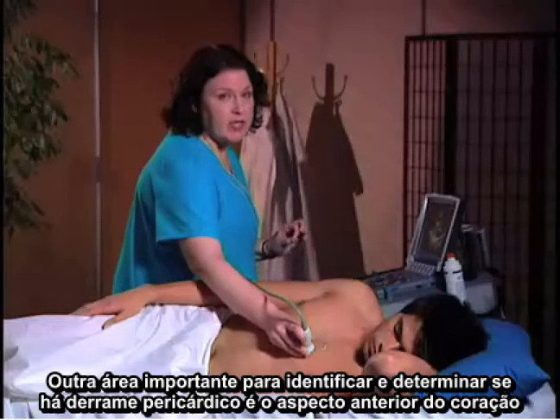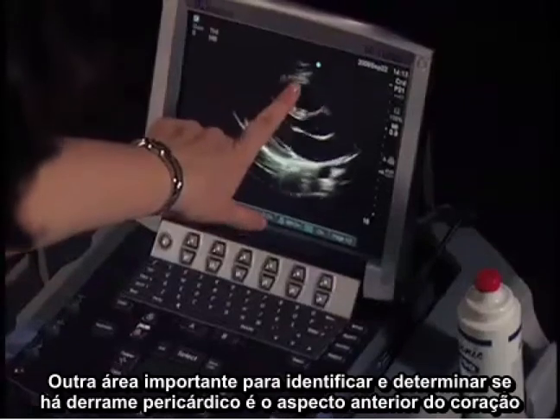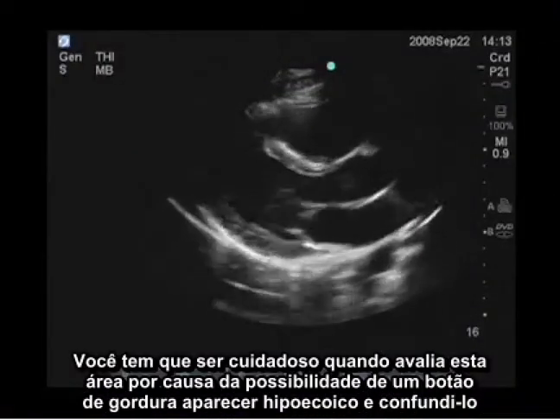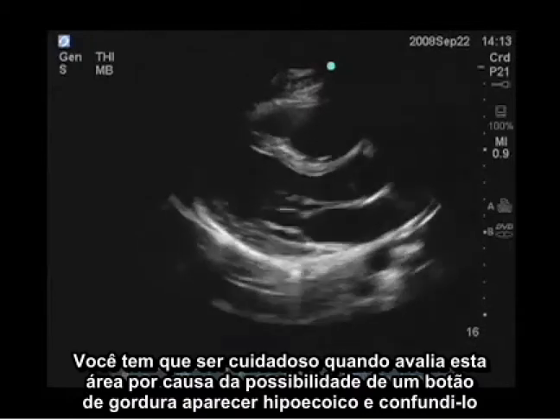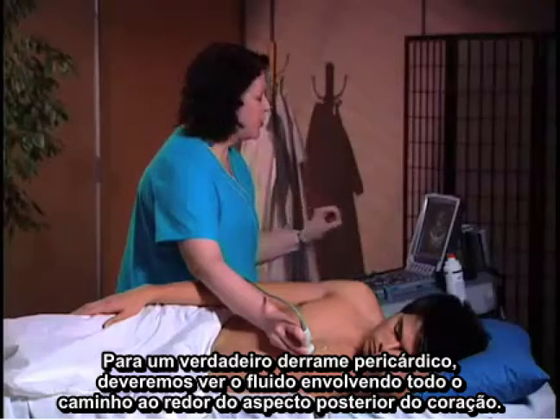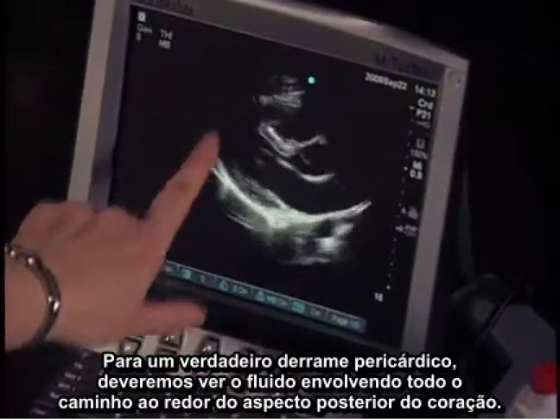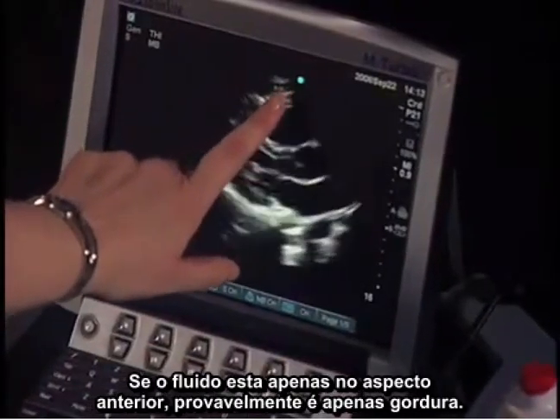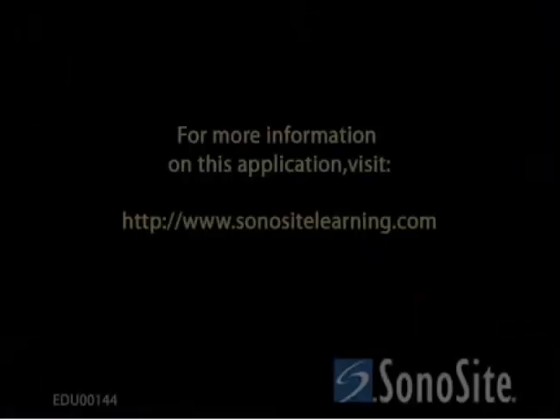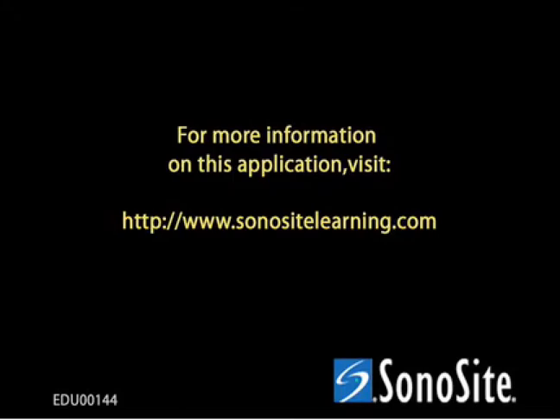Another important area you have to identify to determine exactly where the pericardial effusion is, is the anterior aspect of the heart. You have to be careful when you evaluate this area because there could be a fat pad that appears hypoechoic. For it to be a true pericardial effusion, we want to see the fluid wrapping all the way around the heart to the posterior aspect. If it's just in the anterior aspect, it's probably just a fat pad.